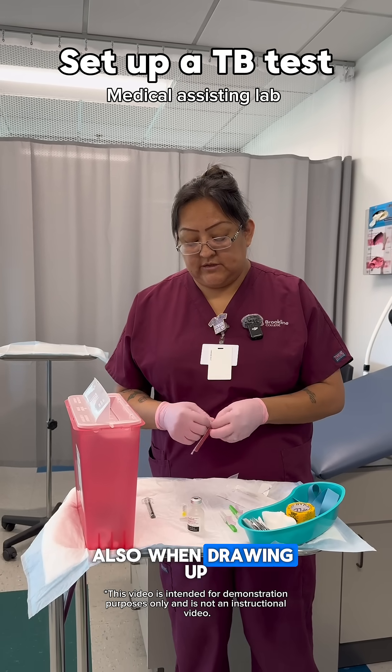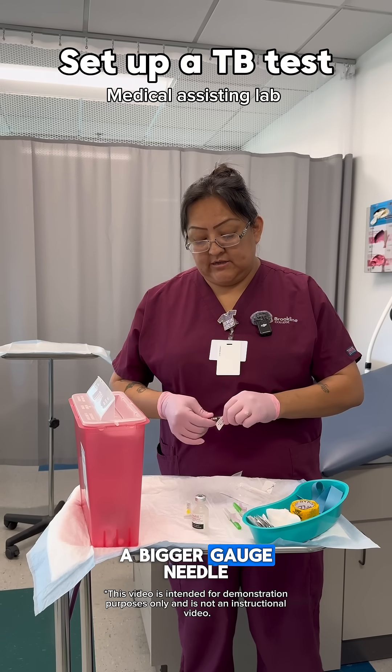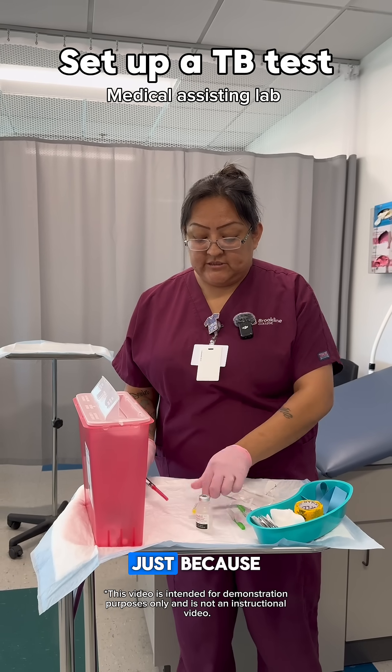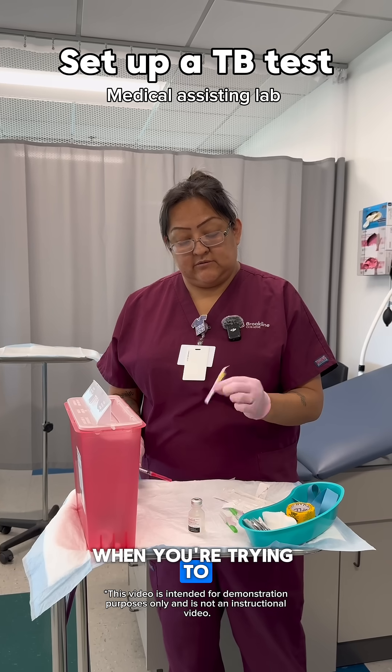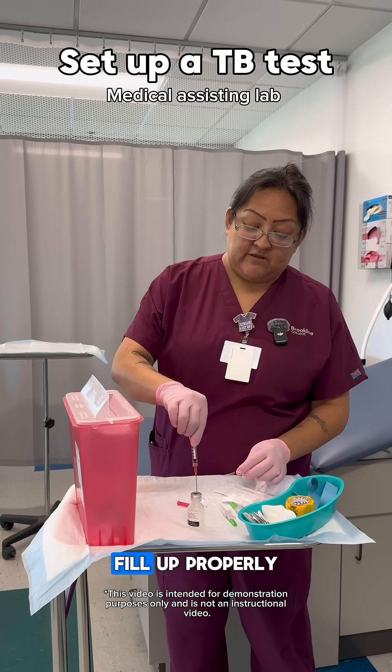Also, when drawing up the medication for TB testing, you're going to use a bigger gauge needle. We use an 18 gauge, just because when you're trying to use a smaller gauge needle, it doesn't fill up properly.